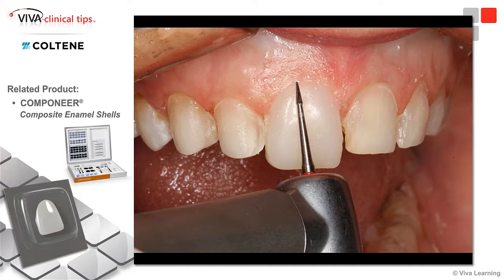Now this is just like any other direct composite at this point, where if I had taken time to layer, placing bonding agent, layering my dentin shade, overlaying it with an enamel shade, contouring all the way, and then even an incisal, that's what takes the time. Here, I've been able to do that in just 2 short steps.